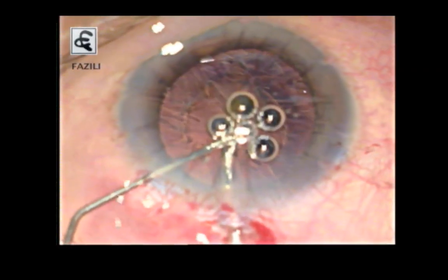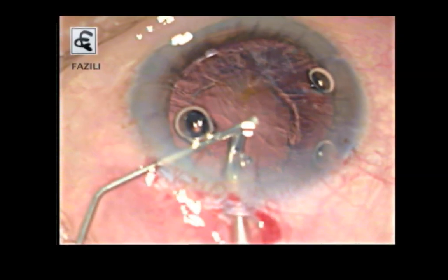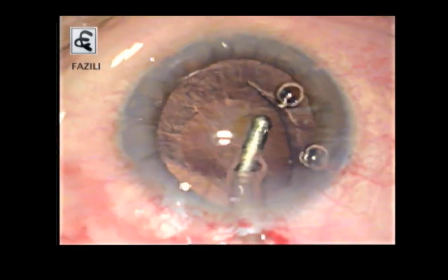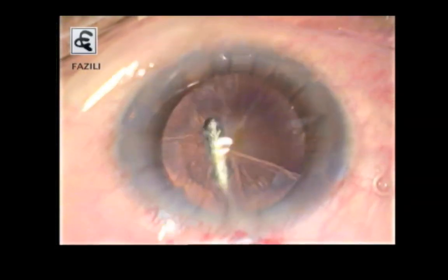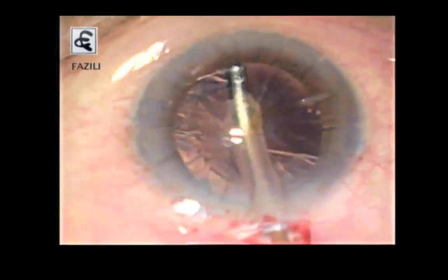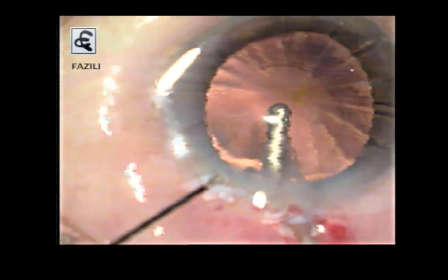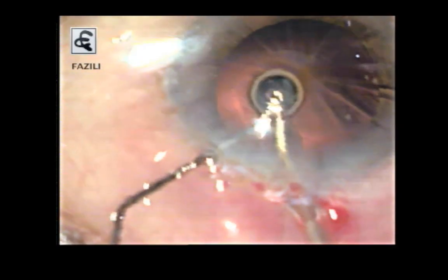You can see I'm going in and injecting some amount of viscoelastic and then coming out with the IA probe, infusion off, going in and cleaning up everything. The cortical cleanup, again, I told you, is very critical. You don't want the capsule to be opacifying very quickly, so that you need a YAG laser. And once that is done, before you take out the IA probe, you go in again and inject.